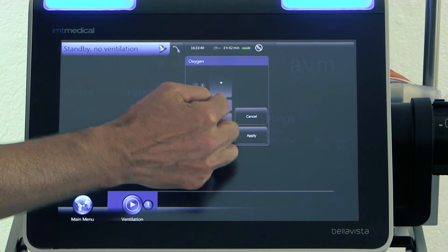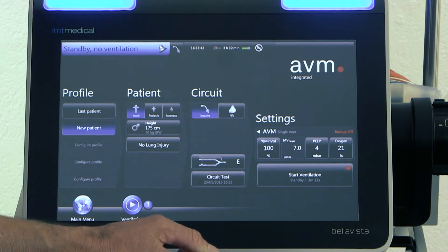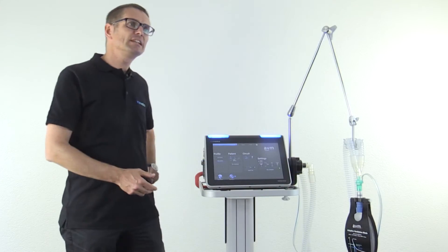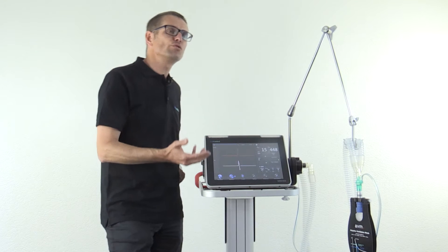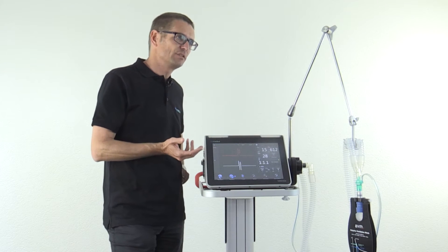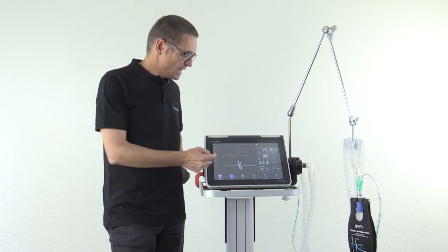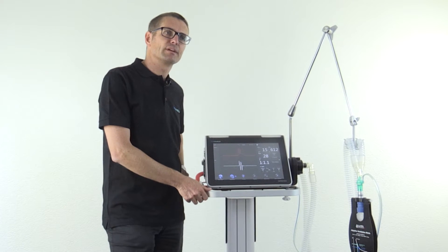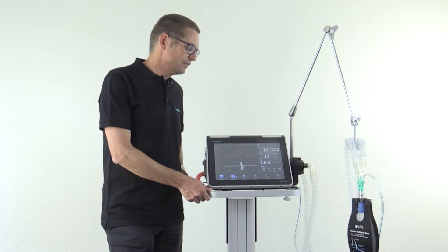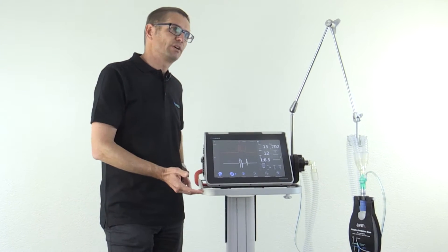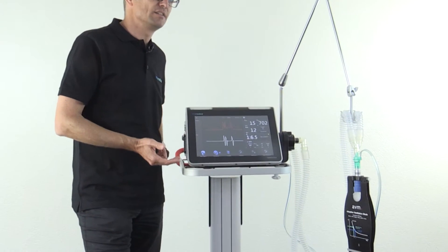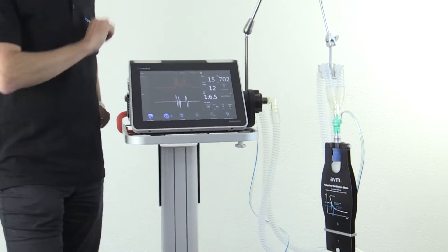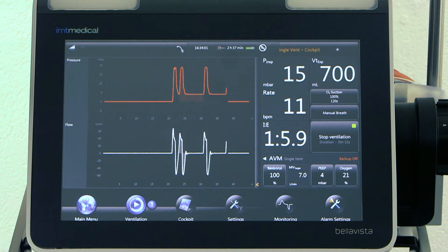So like that, we start the ventilation. Starting ventilation, the mode first has to evaluate the lung of the patient. It does that by delivering three test breaths. After the three test breaths, the biomechanics of the lung is known and the mode will start to adjust.